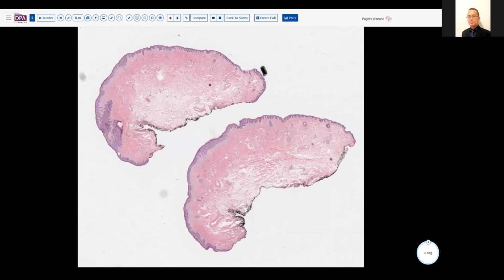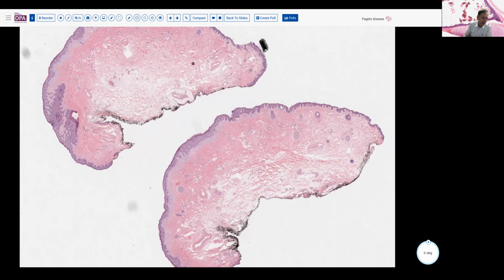Thank you. So our next case, also from the vulva, and one of my goals today was to show you a spectrum of disease in some of these instances, so you see more than just one example and get an idea. So this lesion, again, we're looking at skin with adnexal structures, and we see a little bit of accentuation of the epidermis and a little bit of pale blue inflammation or something around the epidermis. And so we'll begin to look here at the center of this lesion.